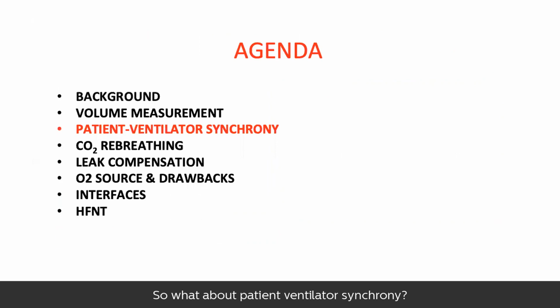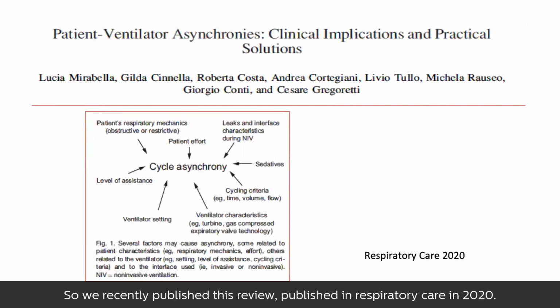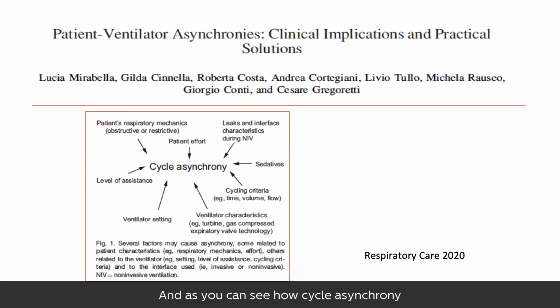So what about patient-ventilator synchrony? Again, a very big problem during non-invasive ventilation. We recently published this review in Respiratory Care in 2020. And as you can see, cycling asynchrony can also be due to the ventilator characteristics, ventilator features. And among the ventilator features, you can also see expiratory valve technology.